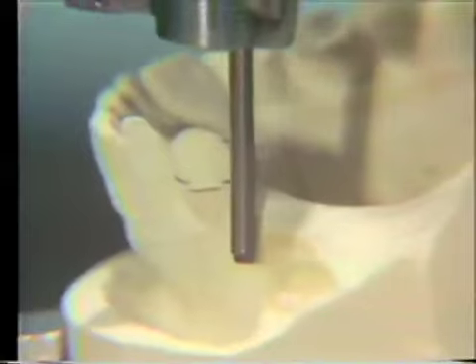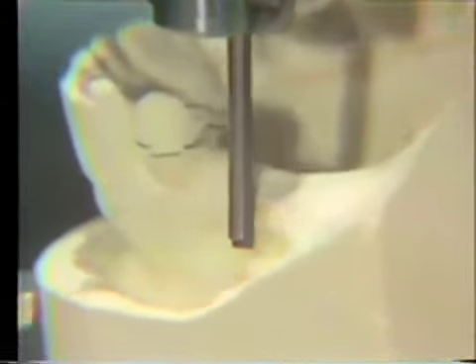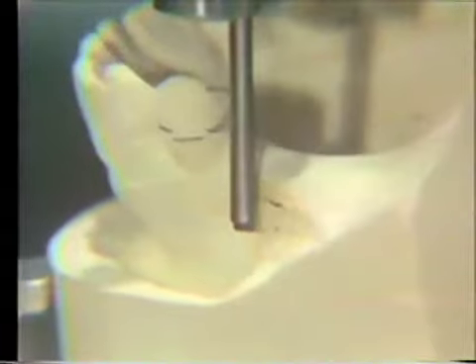Now, while I'm here, I'm going to go down and mark this undercut. Remember, I said we had an undercut in this bicuspid area, and I'm going to mark that undercut on the cast. We can see that undercut. There's a slight drop of wax there, which is not marking perfectly, but we get a good idea of where that undercut is. Now, there's no sense in marking all the way back, but we see that there is no undercut back on the buccal surface.